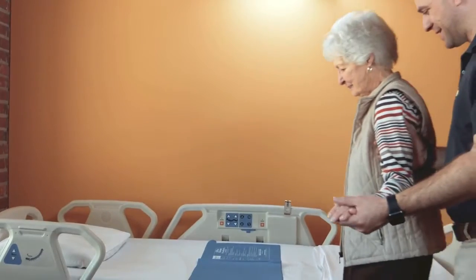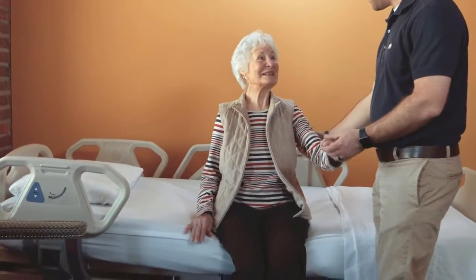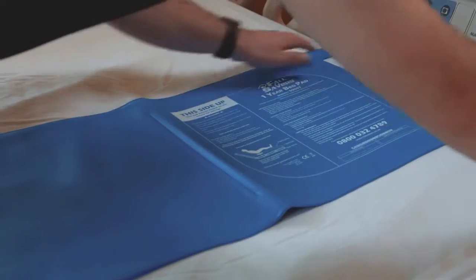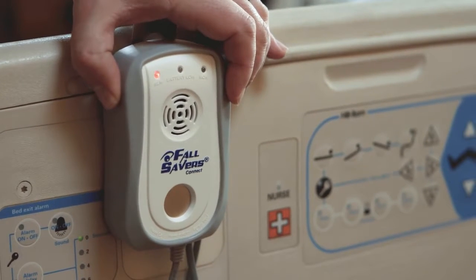You can now position the person you are monitoring in their bed or chair. When you place the patient on the pad, their buttock should be positioned over the top of the pad. Be sure that the sensor pad cord is not on top of or underneath the pad. If necessary, a sheet or towel can be placed over the pad, but additional layers may impact proper operation.